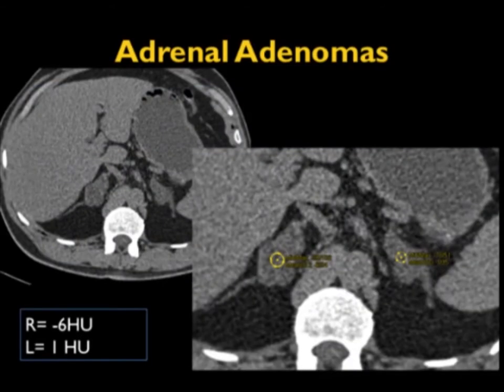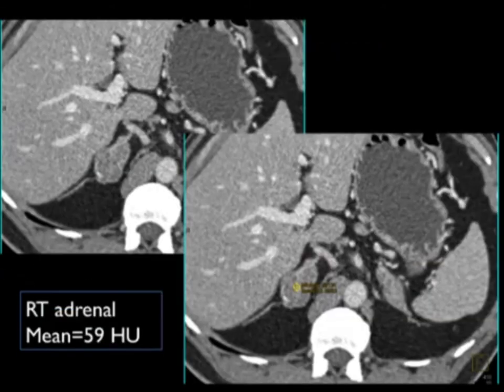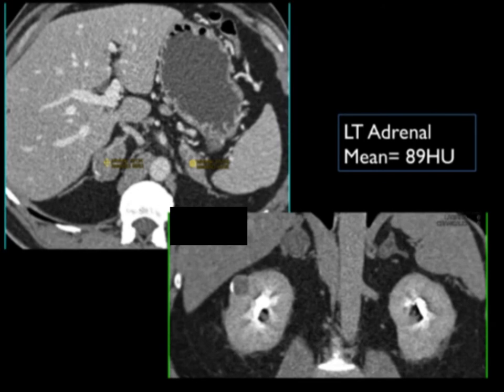These washout values work in patients with bilateral adrenal adenomas. In this case it would have been declared benign based simply on the non-contrast scans — minus six and one Hounsfield units respectively. But when contrast was given, the right adrenal went to 59 and the left went to 89 HU. You need to be very careful: if you only have arterial phase imaging, you really could not make the diagnosis of a lipid-poor adenoma in those scenarios.